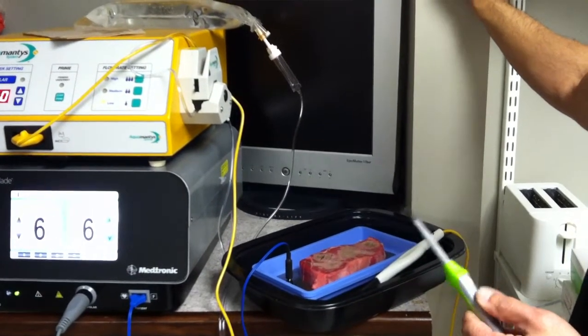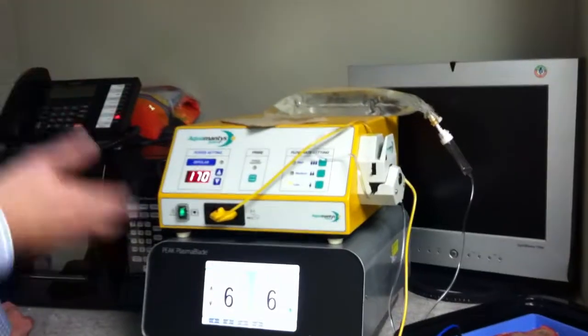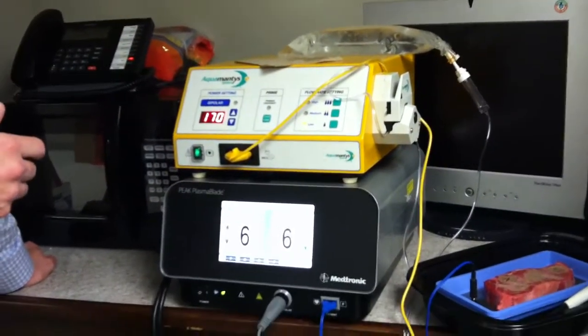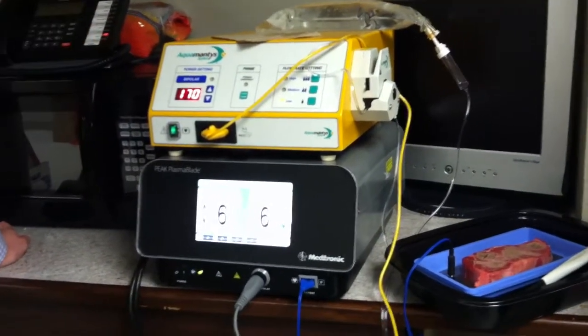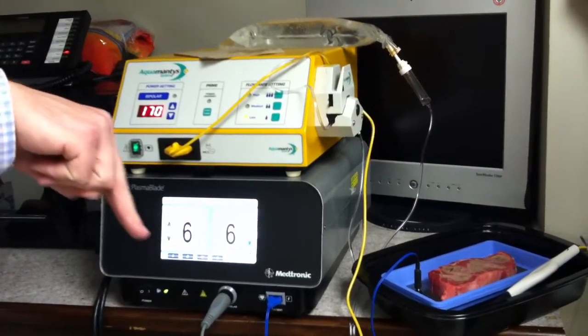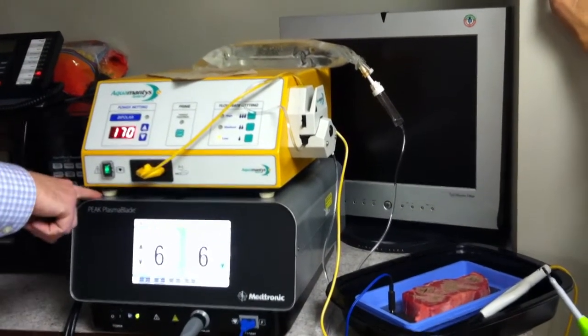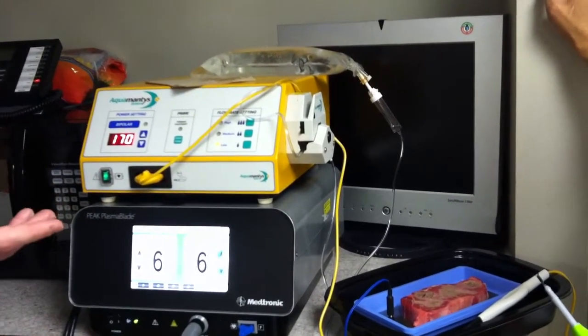Right. But it's also a pulsed radio frequency. So essentially what it's doing, with the water and other ions in the skin, it's generating a plasma field, a conductive field as you're cutting through. So that's why it's so smooth. It just slides through with very little drag. But I think the smaller surface area, the pulsed radio frequency, and the less thermal output all contribute.